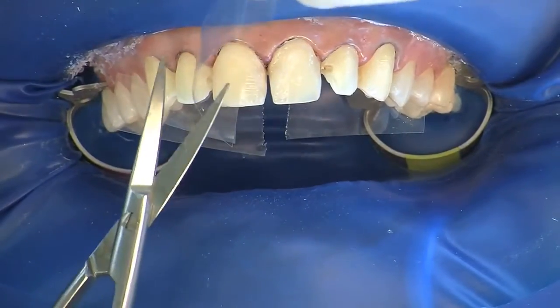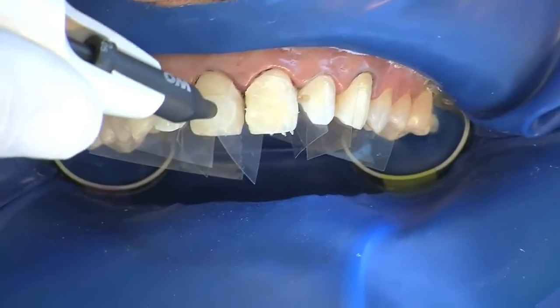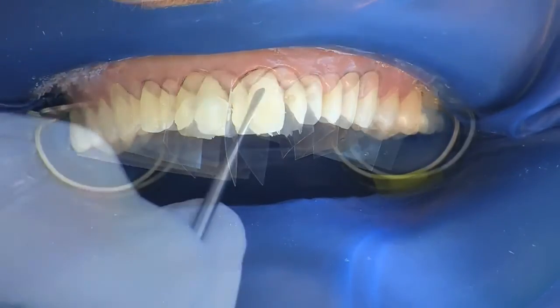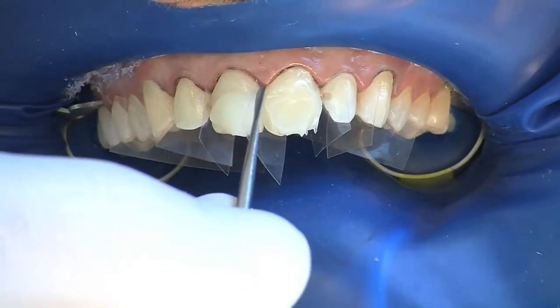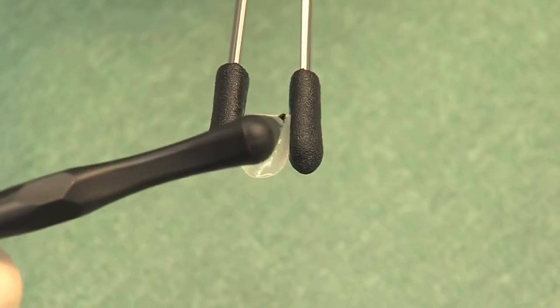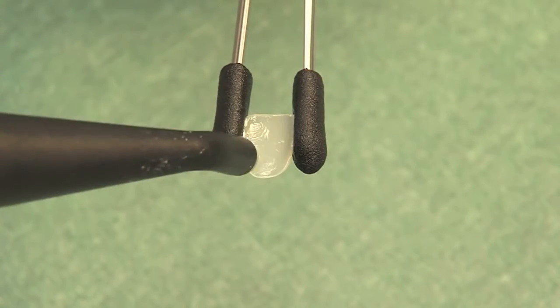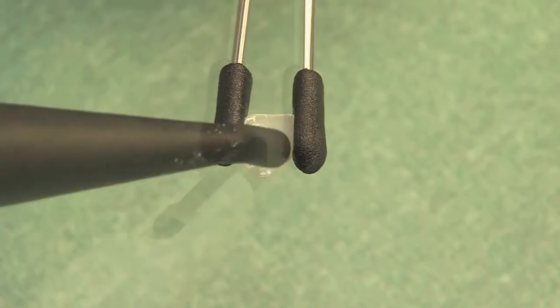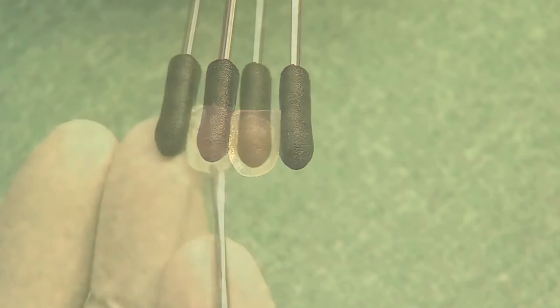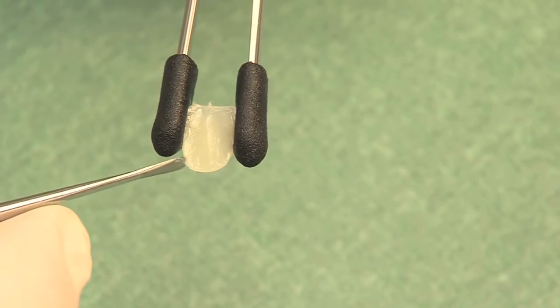Separators are now placed to ensure clear tooth access. The selected luting composite is applied directly to the tooth and evenly distributed. One coat bond is applied to the inner surface and the margins, blown to a thin layer and not pre-cured. The luting composite is also applied to the componeer in order to avoid air inclusions, and exact marginal adaptation is important.